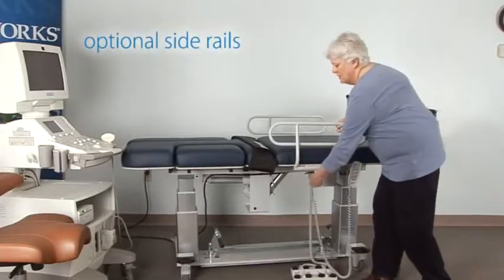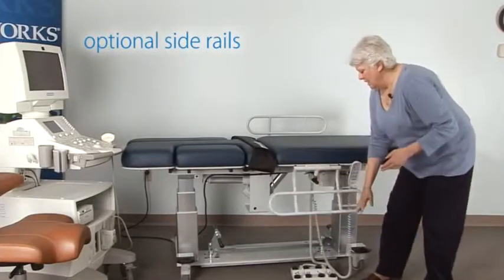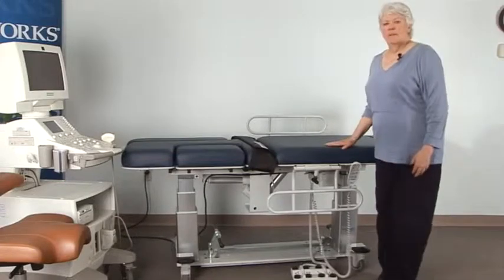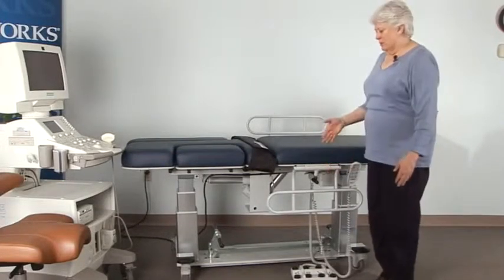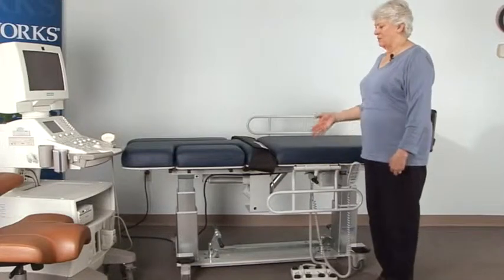Another option is side rails. They can be added to any table and they're easy to operate and swing down out of the way so that they do not increase the distance between the sonographer and the patient.